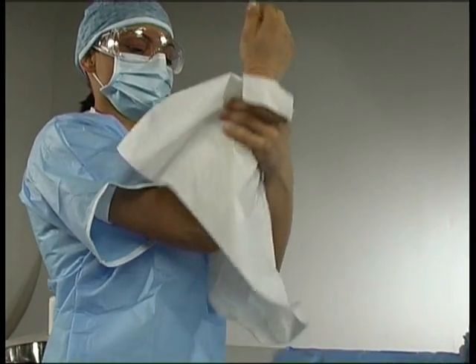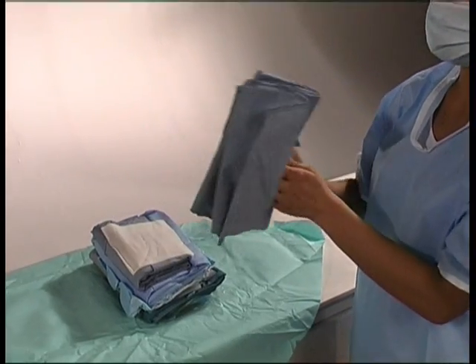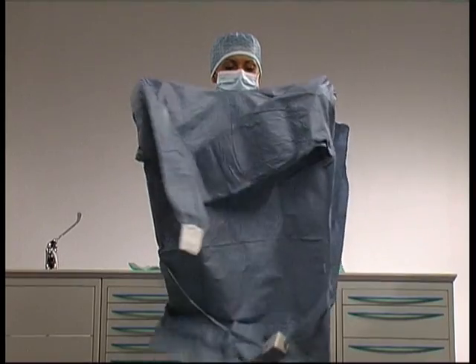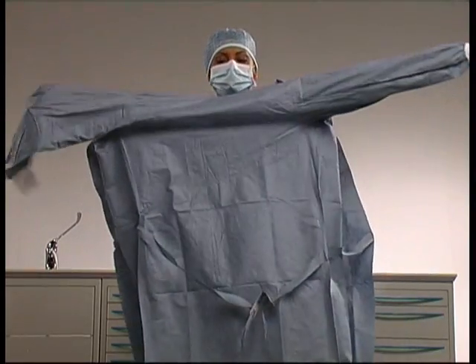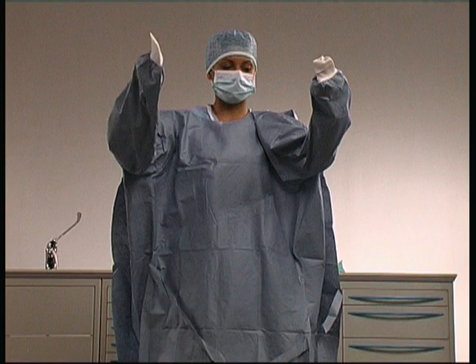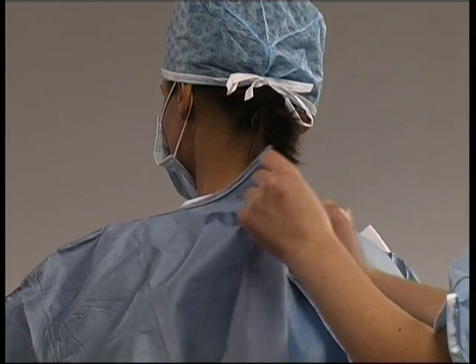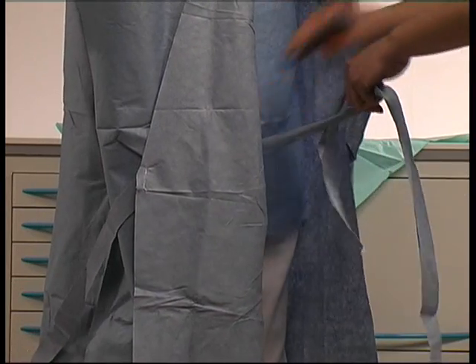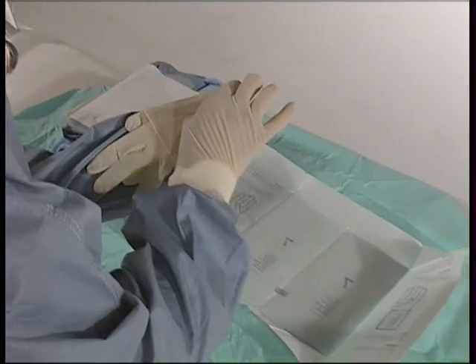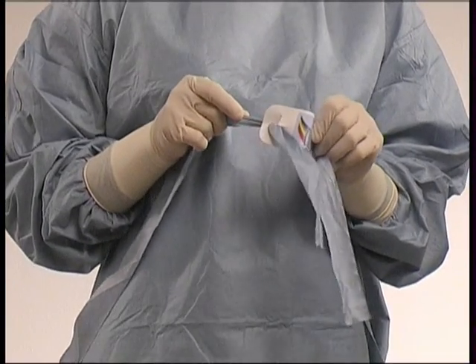The washed assistant takes a sterile towel and dries herself. With the help of the non-sterile assistant, she starts to dress. First, she takes the surgically folded gown from the packet. She puts her hands into the armholes, taking care not to touch the outside of the gown, and slides her arms in, keeping her hands inside the cuffs. The non-sterile assistant fixes the gown at the top with the velcro and at the waist using the internal ties. Having taken the gloves from their wrapper, the assistant puts them on by herself. Then, with the help of the non-sterile assistant, she fixes the gown with the external ties.